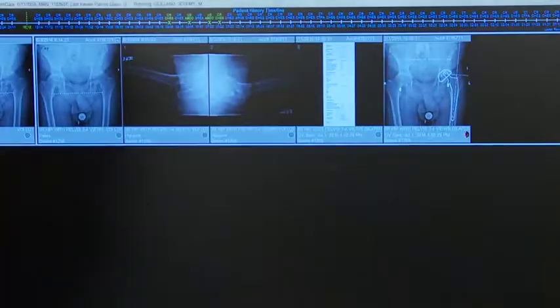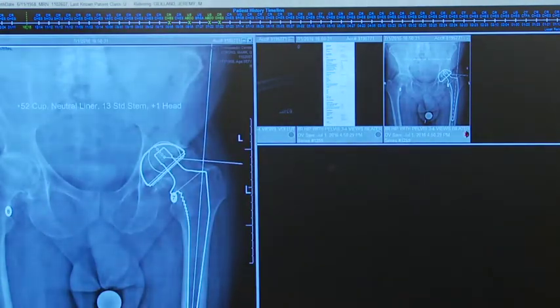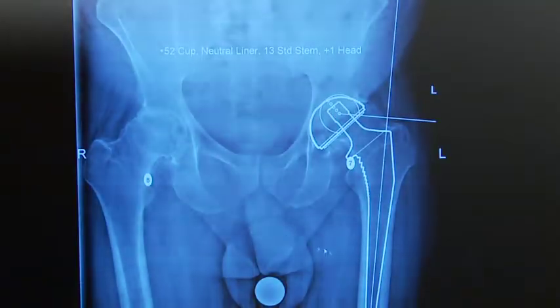Nonetheless, I'm still going to template him to see if my parts seem to fit very well. And I will sometimes template the operative or the non-operative side as well to see how they would fit. But here, when I templated his hip, you can see that my cup position, I decided to place it right down to the teardrop medially in order to tuck it underneath all of this erosion that he has superiorly.